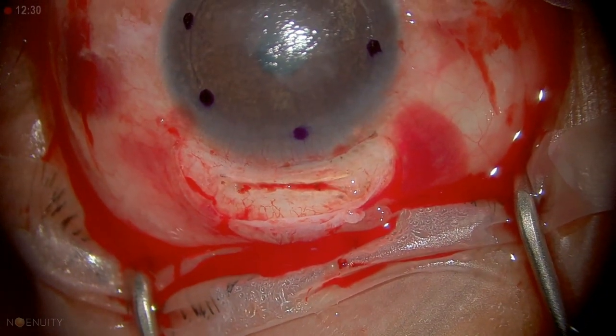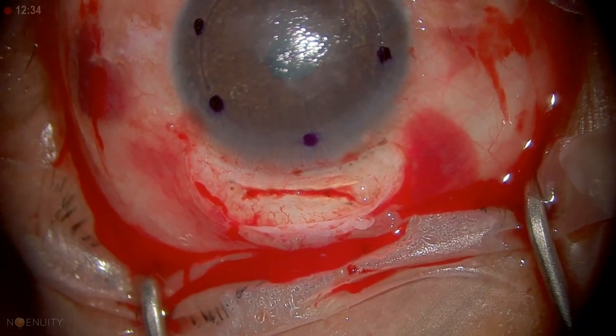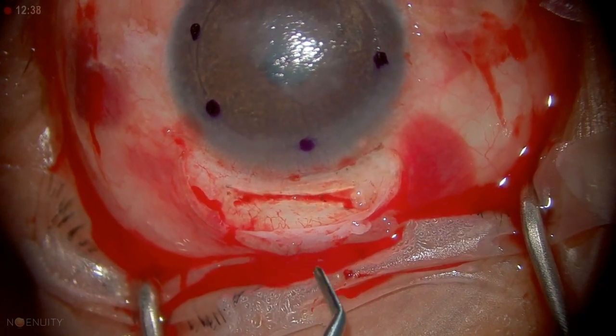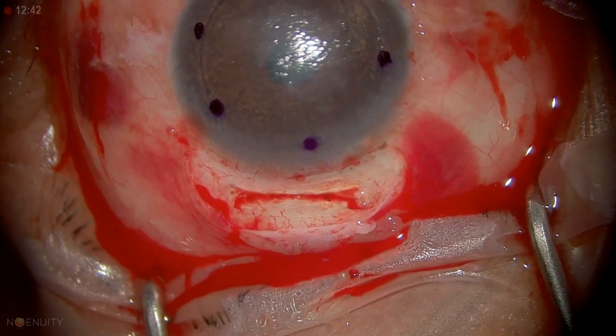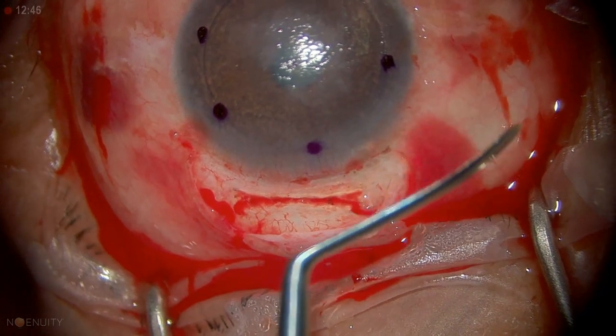This is what that spatula looks like — it's called a Morlet spatula, made by Duckworth and Kent. There are two sides to it: one with more of a cutting blade that you use to enter and gauge depth, and the other for dissection. You can see it can reach across the cornea, and it has a little bit of a curve to it.